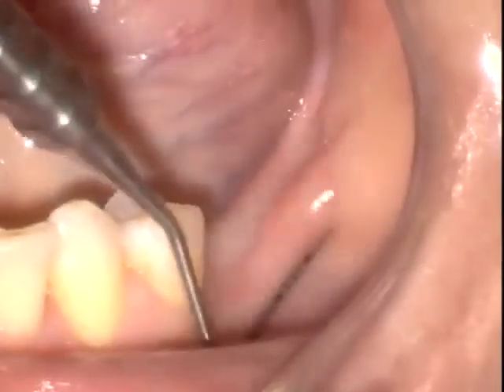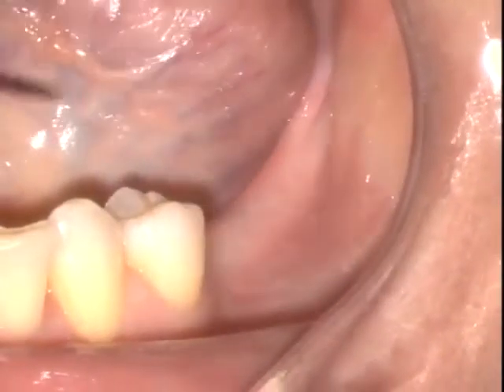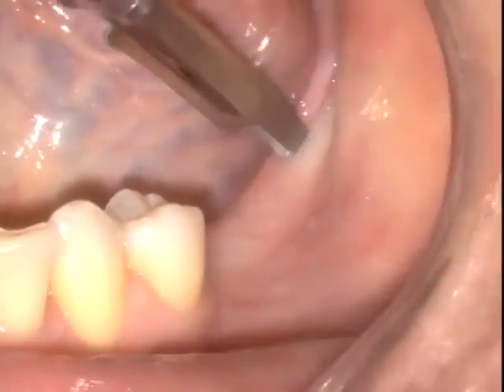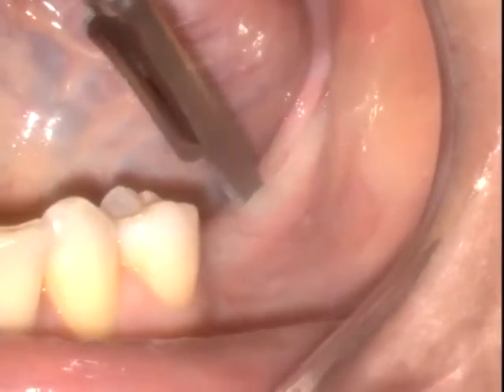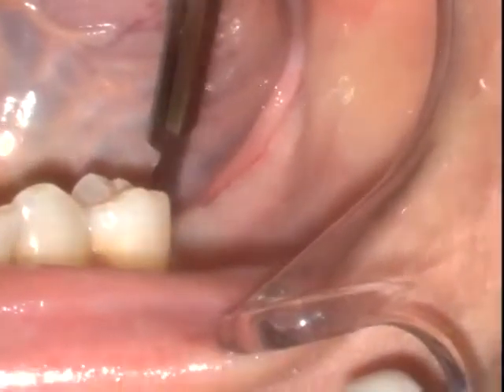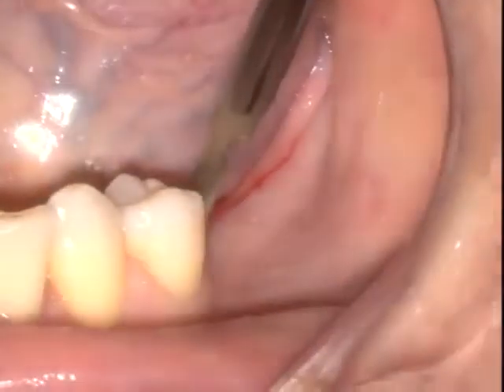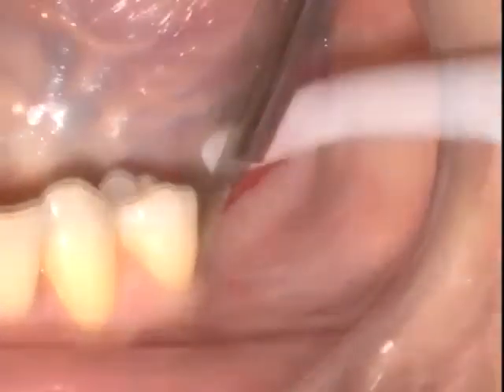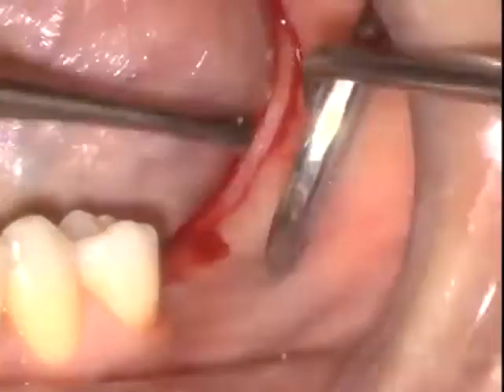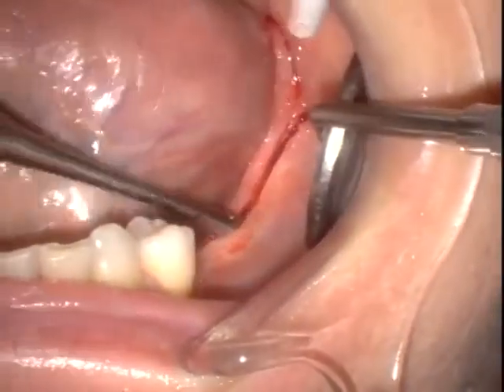We also intraorally inspect the mucosa to keratinized tissue position, and it's obvious here that we're going to need to position the keratinized gingiva carefully towards the buccal as part of our implant treatment. We want to have at least 2 millimeters of keratinized tissue on both aspects, buccal and lingual, of the future implant restoration.